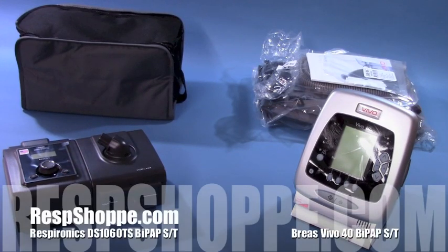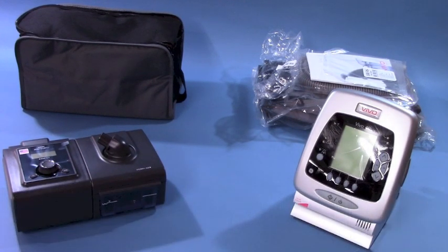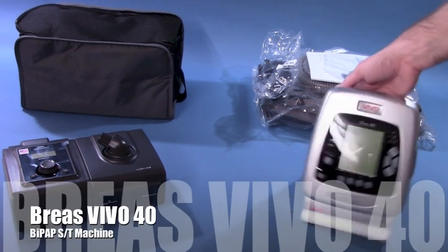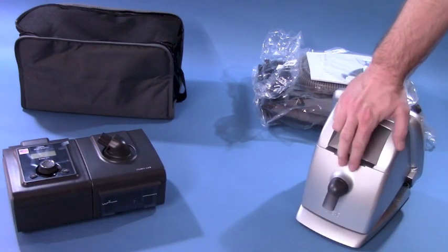Get clinical quality respiratory therapy at home with the Breus Vivo40. With three ventilation modes and a maximum pressure of 40, this device has the last word on non-invasive and invasive respiratory support.